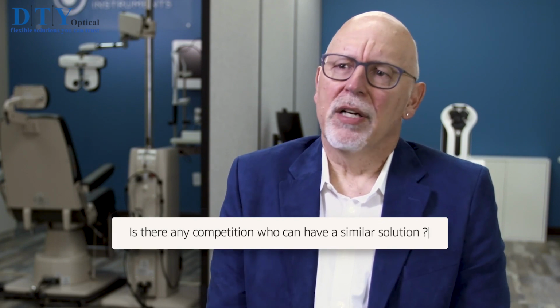Well, we've had automated phoropters for quite some time. But remember, it's just an automation of the old analog phoropter. It still uses the same spinning wheels, the same potentially obsolete technology that we've been using for 50, 80 years. Now, there are some new solutions. So Topcon has a system I think they call the Kronos system, and Lenomed has a thing called the iRefract.